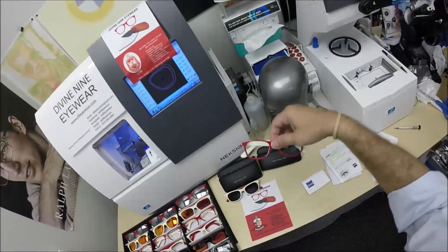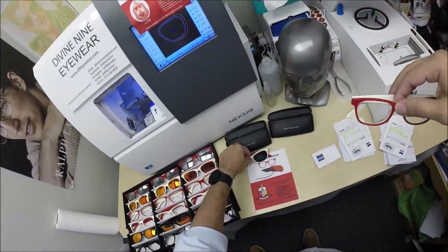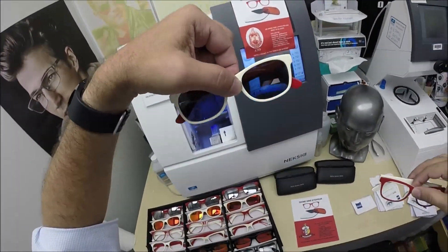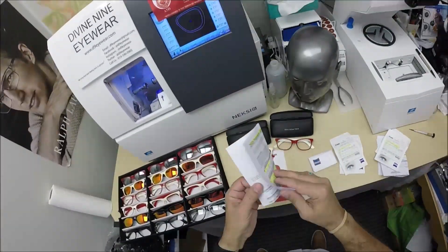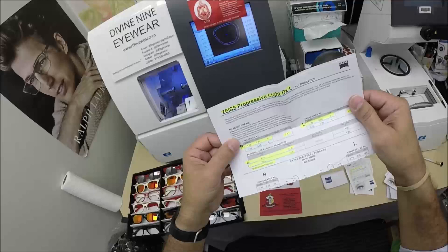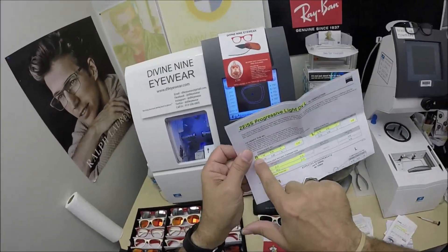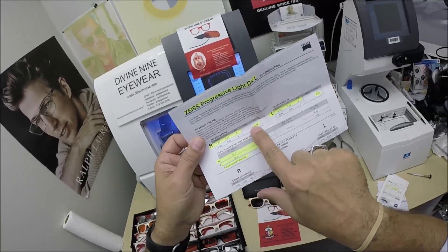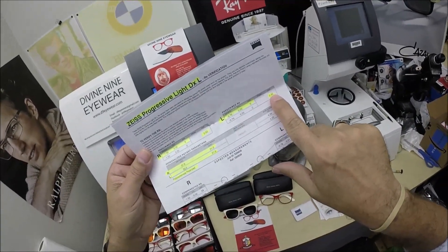She got one pair of Zeiss progressive lenses with the DuraVision Chrome anti-glare coating, and one pair of Zeiss polarized progressive lenses. The nice thing about Zeiss is they document everything. I've highlighted the Zeiss Progressive Light D digital free-form progressive, the prescription for the right eye, the add power, same for the left — the add power, which is the progressive strength.